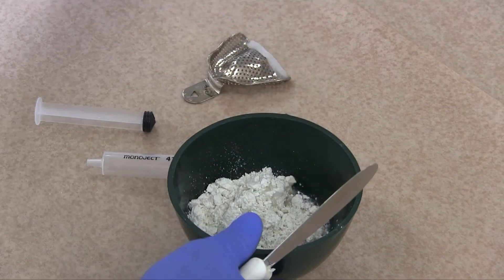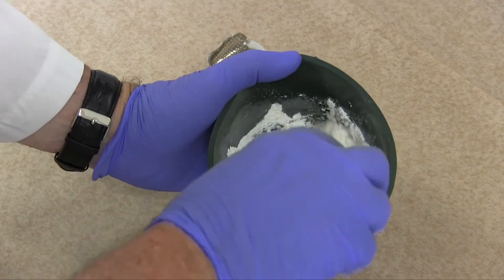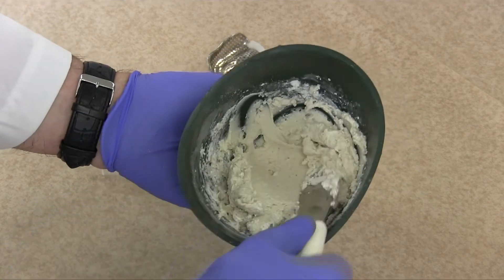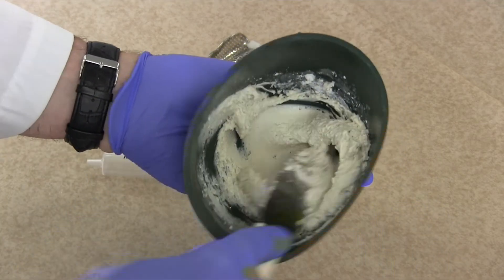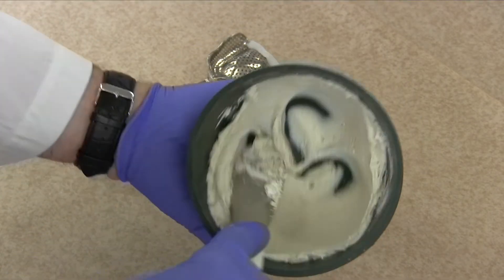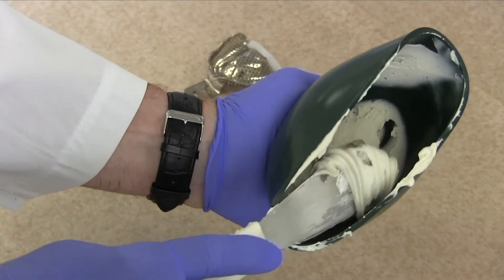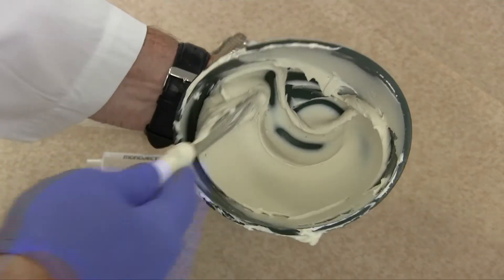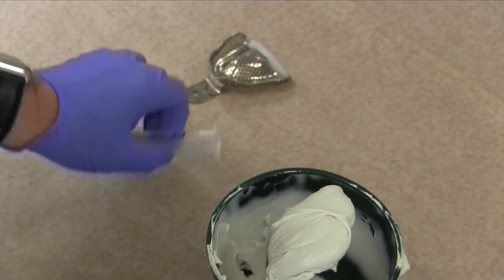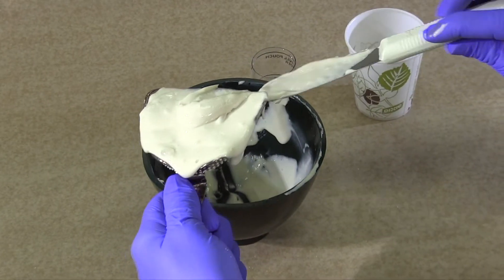Combine the powder and the water in a mixing bowl and mix according to the manufacturer's specifications. Ensure that all the powder is incorporated into the liquid. A stropping technique can work well. Use the side edge of the spatula to gather up any extra powder on the sides or bottom of the bowl. Wipe off the blade of the spatula occasionally in case there's some unmixed powder on it. The completed mix should glisten and there should not be any appearance of granularity on the surface.